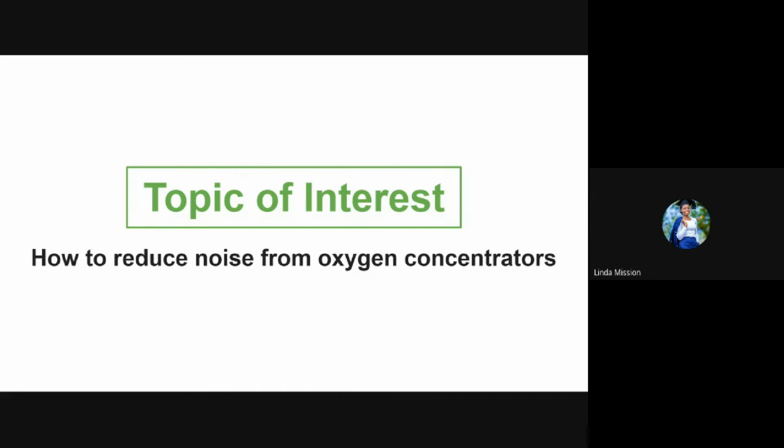And also, if you are exposed to noise of a level above 120 decibels, it can cause immediate harm to your ears. So different brands or models of oxygen concentrators produce different levels of noise.